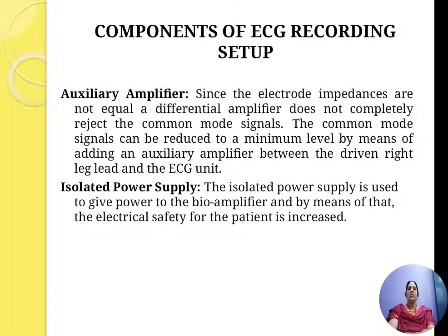Then the last stage is your isolated power supply. The isolated power supply is used to give power to the bioamplifier, and by means of that the electrical safety of the patient is increased. To increase the electrical safety of the patient, the isolated power supply is used.